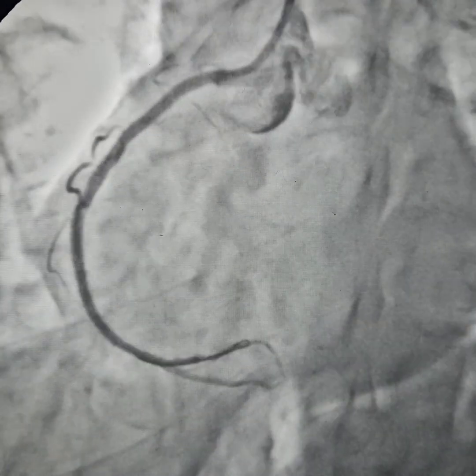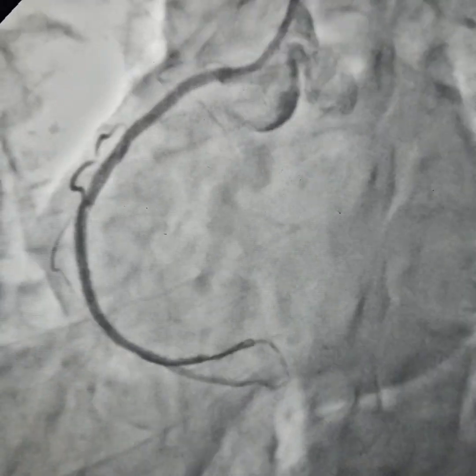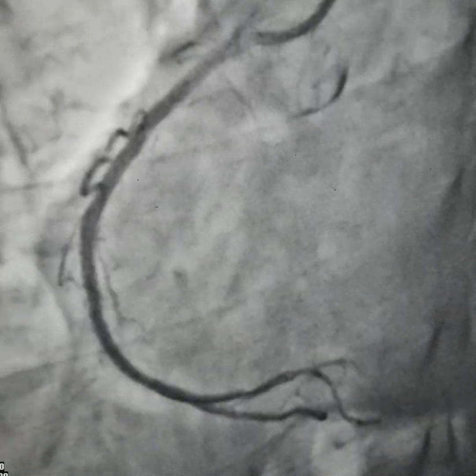Good post-dilation of the overlapped segment and the tightest portion has been done. We're moving upwards at about 18 to 20 atm pressure, doing some more post-dilation. Very good post-dilation has been achieved with the 3.5 mm balloon.